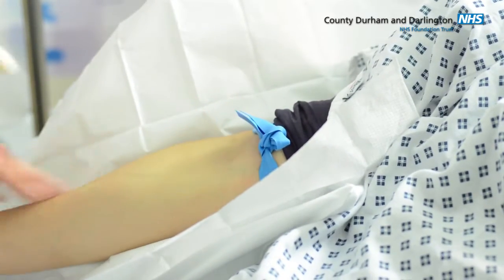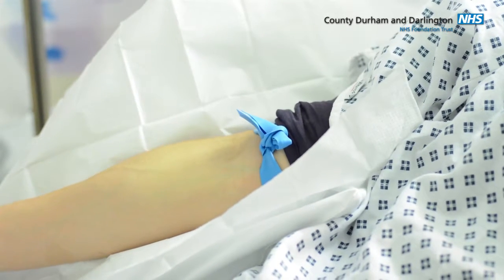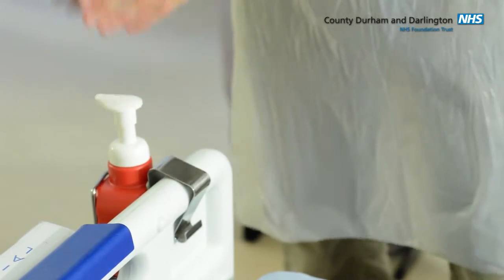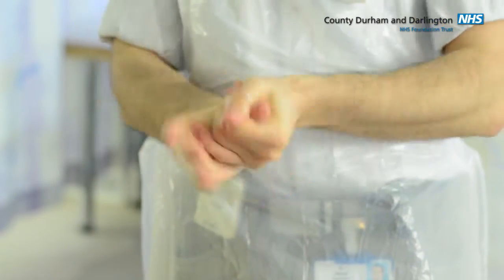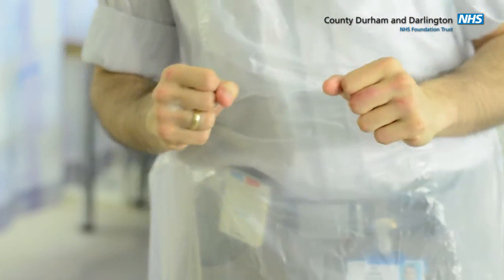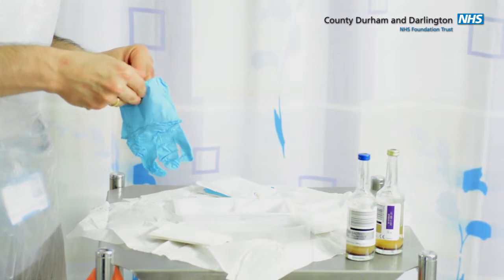Should be fine. Alright, so I'm just going to put my gloves on then. Wash your hands with the alcohol sanitizer foam and allow to air dry. And then put on your sterile gloves.